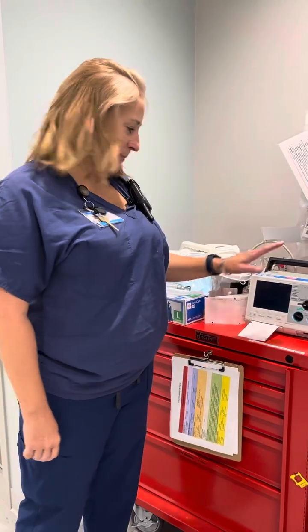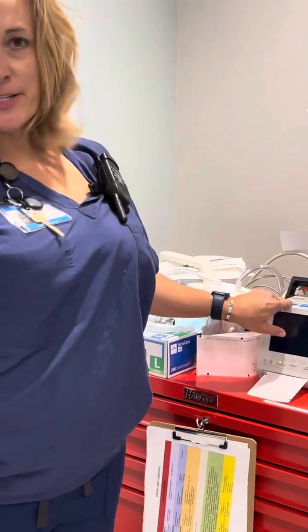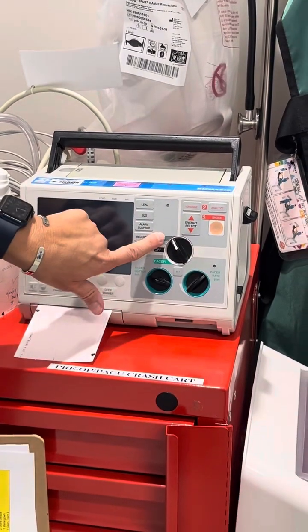This is Dawn. I'm going to show you how to discharge your Zoll M-Series Biphasic Defibrillator. You're in your on position. You're going to turn it to position one.